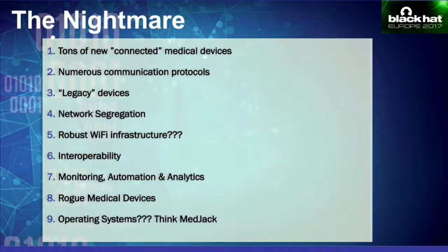Right. So we've talked about some of the benefits. Here I'll just touch upon some of the challenges that come with connected medical devices. I think one of the biggest challenges for medical institutions and health institutions would be to support this large and growing number of connected medical devices. There are already tons of connected medical devices per bed in hospitals.